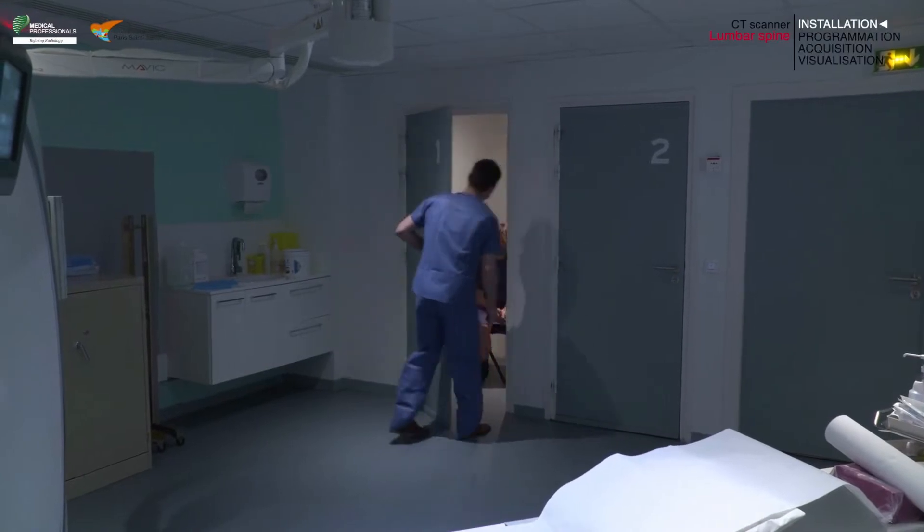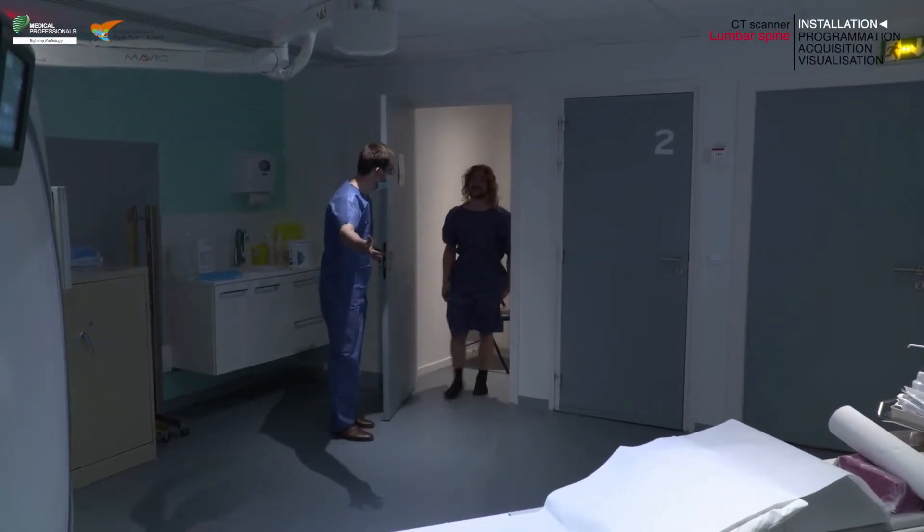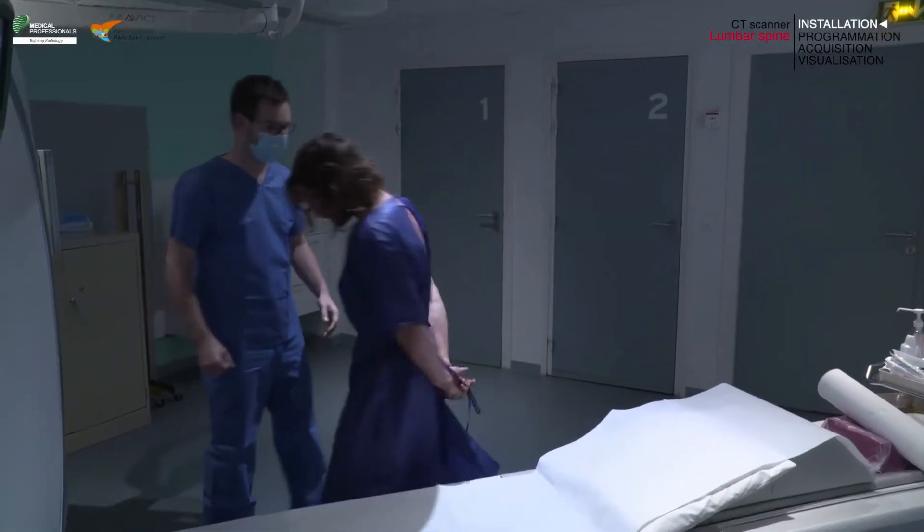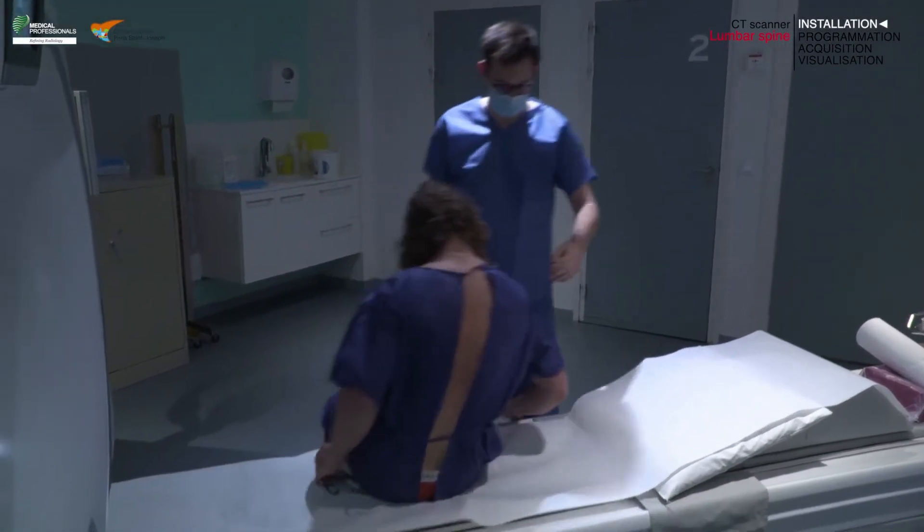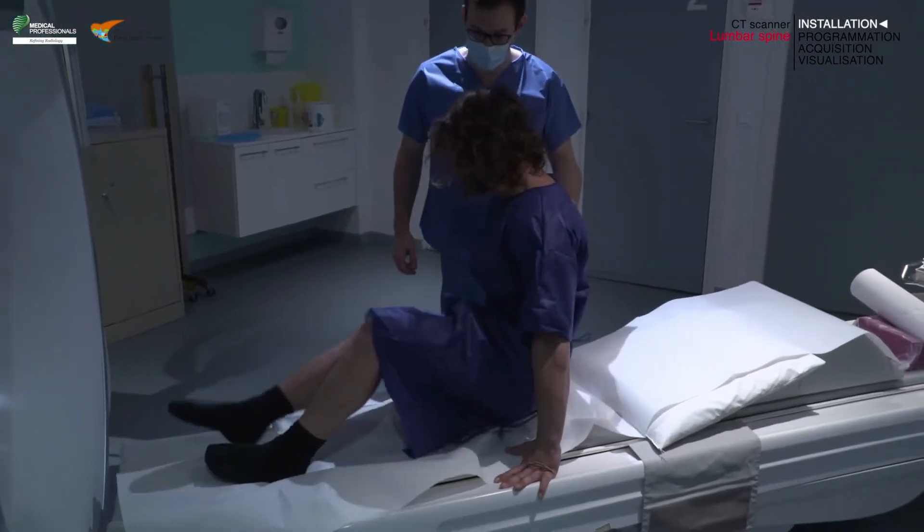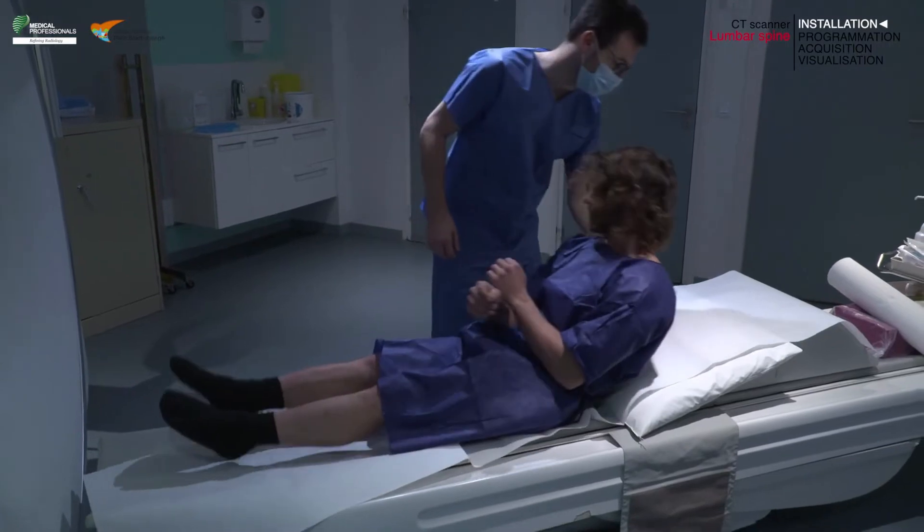After verifying the patient's identity using at least two identifiers, such as first name and last name and date of birth, place your patient in a supine position with their arms above the head.